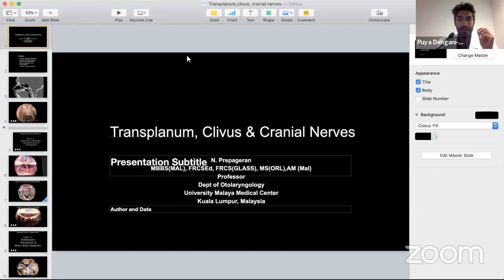Today, Professor Prepageran is going to talk about the transplanum, clival, and cranial nerve approaches, and the anatomical boundaries and all the anatomical structures that you will encounter if you want to perform an endonasal procedure through an endoscope.